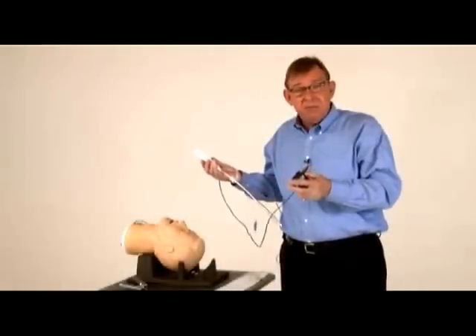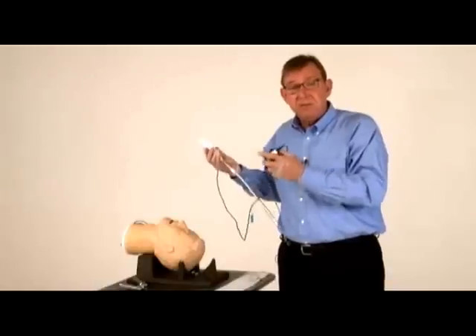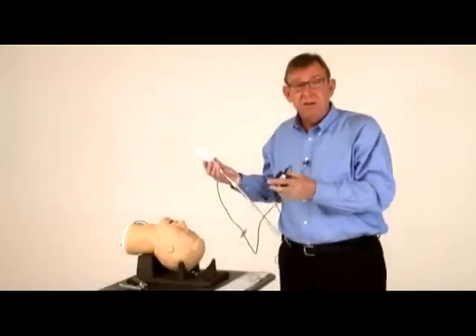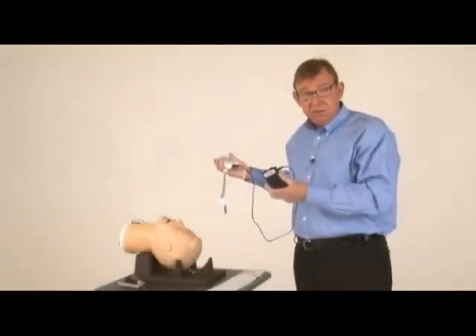What many EMS providers are really excited about is the ability to take a JPEG still image of the tube lodged inside the trachea to make it part of their electronic patient record. That's the PIC-Stick DVR for ViewStick.